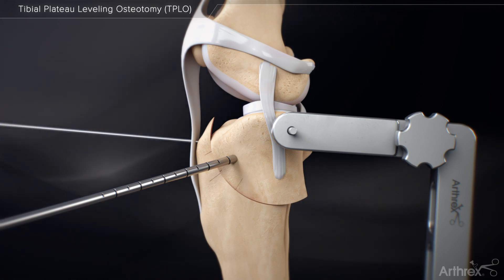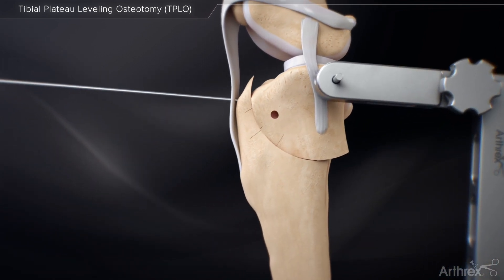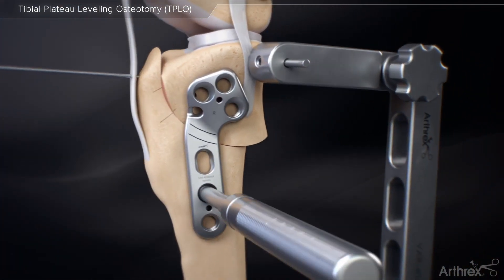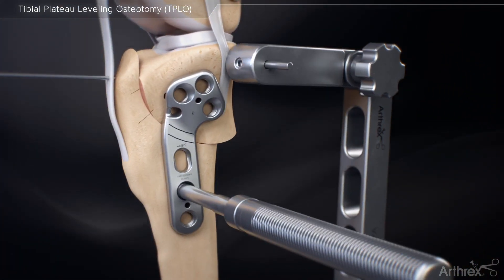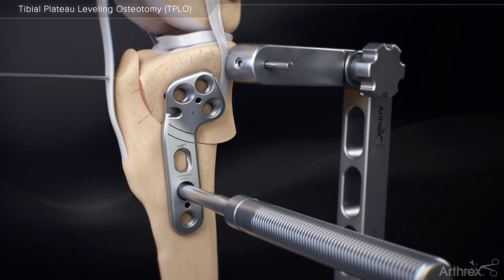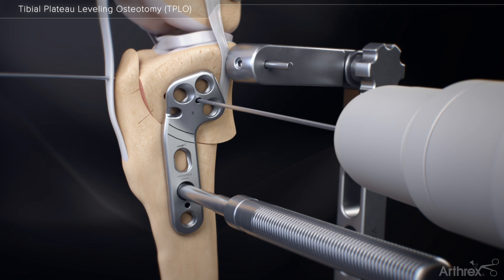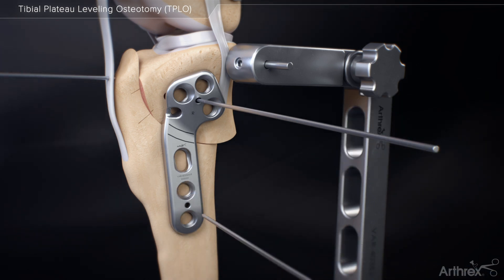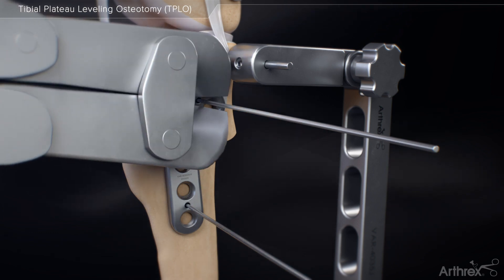Remove the rotational pin. To properly align the TPLO plate, use the locking plate holder to place the proximal screw holes in the center of the proximal fragment. Place the distal portion of the plate in the center of the distal fragment and align the laser lines with the osteotomy. After placing the plate in the center of the proximal fragment, insert the proximal K-wire. After aligning the plate with the tibial diaphysis, insert the distal K-wire to secure the plate.